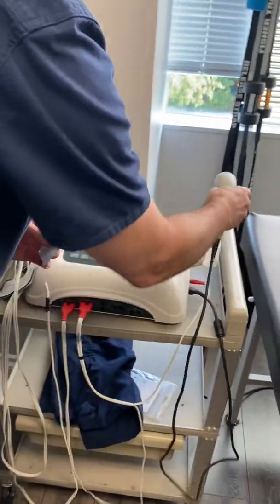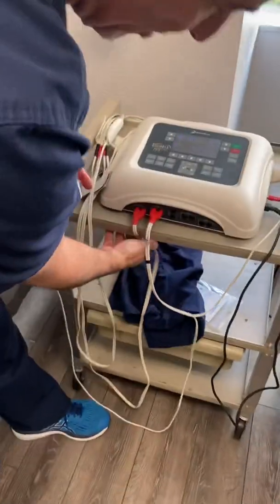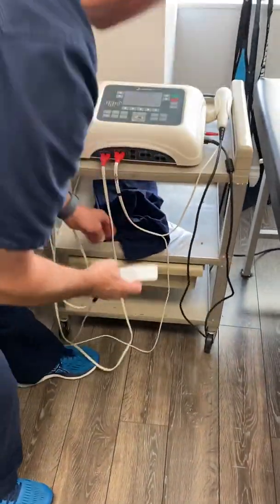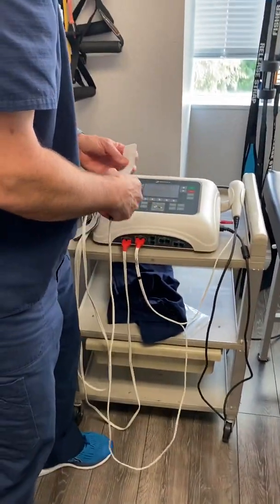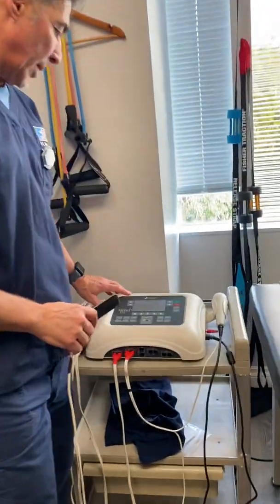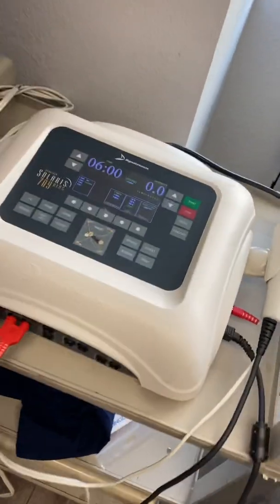Okay, so now what we're going to do, let's hope, you know what I might need to do is we're going to set this up, and then I'm going to get some ultrasound gel, and we're going to put this on Sierra, our intern, who's also our patient model. Okay, so first we're going to get this up. We'll get this up to 6 minutes.